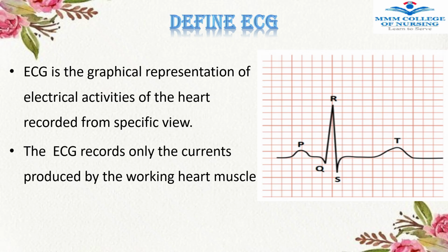Electrocardiogram is defined as a graphical representation of the electrical activity of the heart, which is recorded in a specific view. Remember, the ECG records only the current which is produced by the working cardiac muscle.